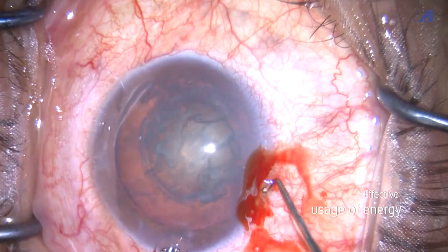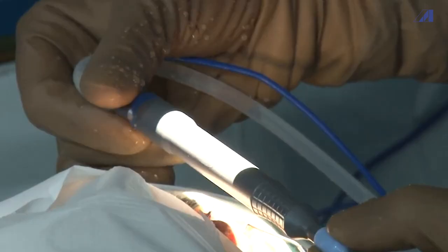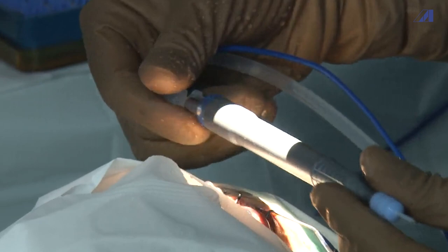The orbital moment technology in the handpiece ensures effective usage of energy by covering larger area with least energy level and with utmost safety at a shorter duration.